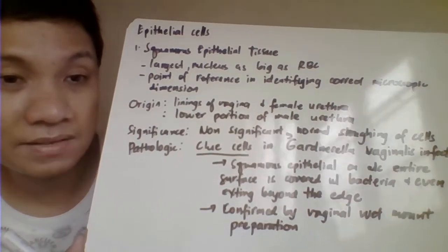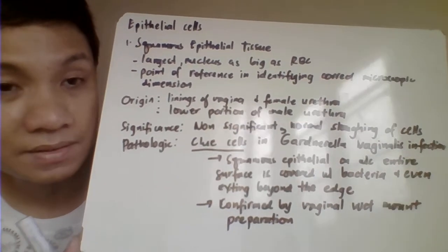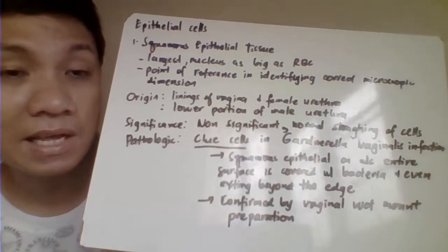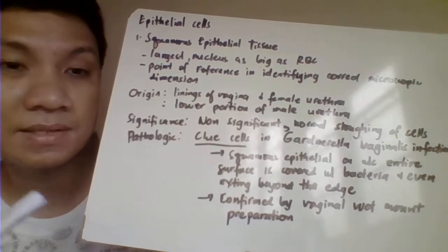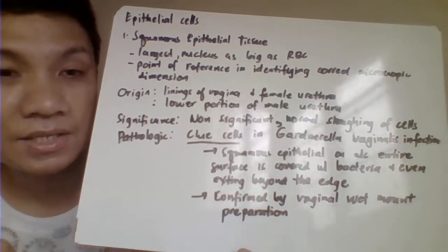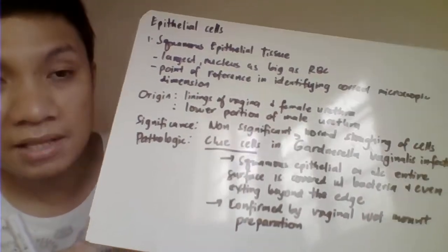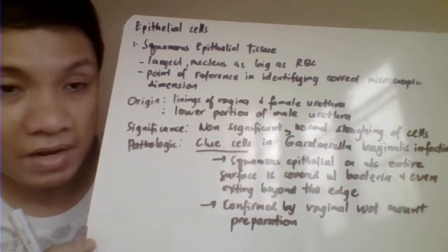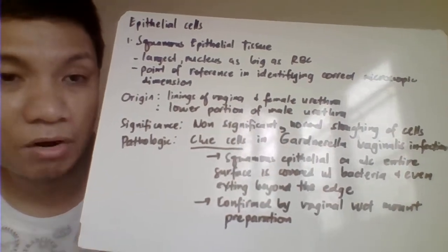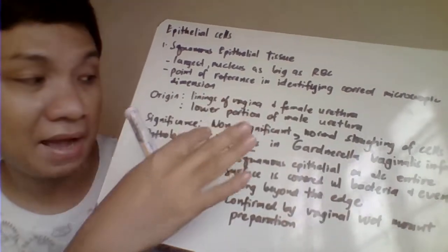Okay, basically it just represents the normal sloughing of the cells. So that means, most likely either hindi ka nag-collect ng midstream clean catch or hindi ka nagpunas ng kanyang genitalia ang ating patient. Okay, and then again, a problem with that, hindi siya significant, but then again, pag madami ang squamous epithelial tissues natin, it might obscure your microscopic identification, especially for those cellular constituents natin which are small, like RBC or even your WBC, which are more significant kasi natatakpan niya.